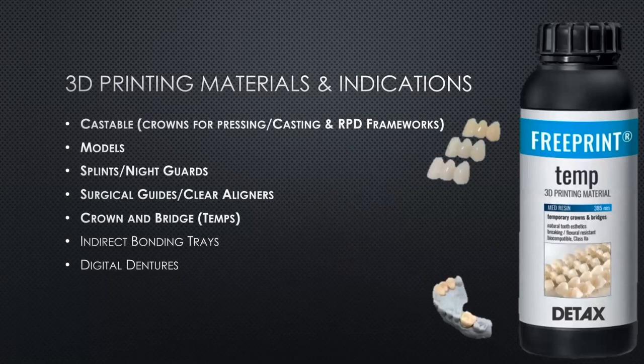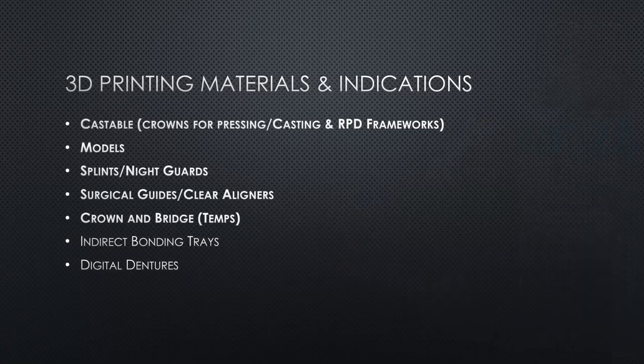Okay, so for the fabrication of clear aligners. A lot of the pioneering in dental 3D printing can be credited to one company, and that's Invisalign. They were the first company to really go out there and use this technology on a mass scale.